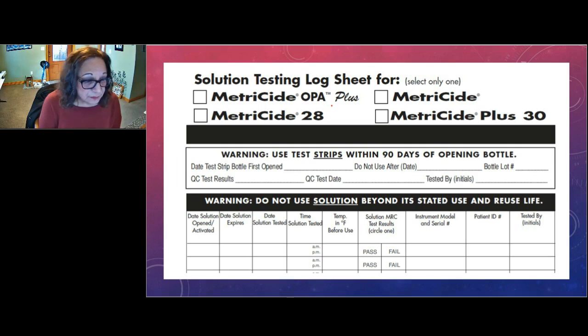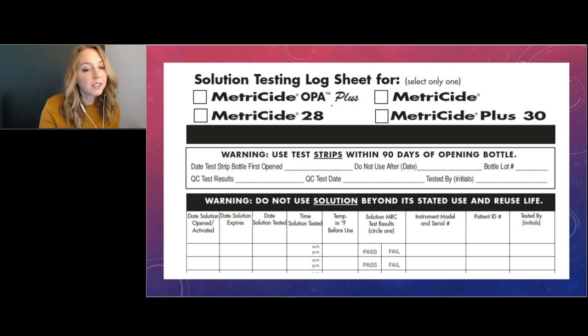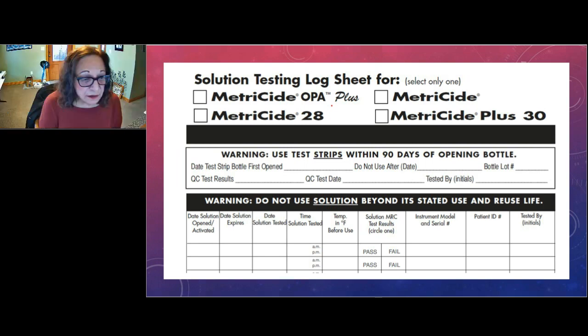Next question. Could the cold sterilization process replace heat sterilization safely and effectively? No. This is kind of a tricky question. If you think about sterilization, the point of sterilization is to kill everything, right?